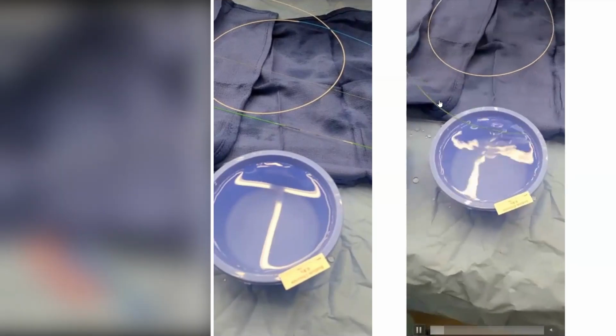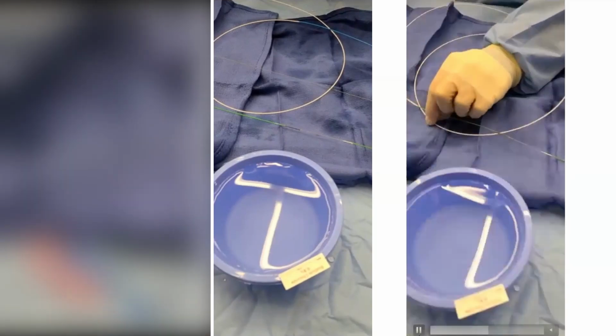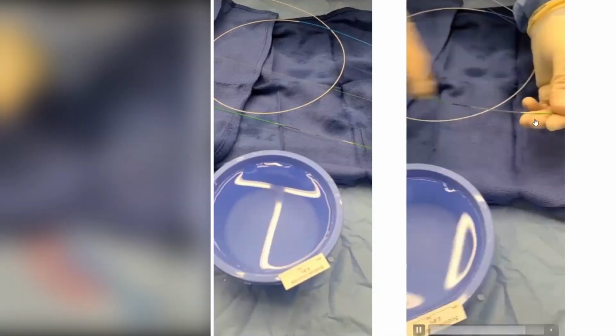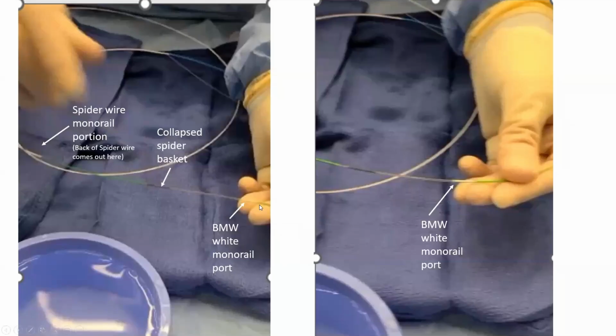So we pull it in the catheter and we position it, as you will see, in that transparent portion here. Then we advance that green catheter over the BMW wire, and the BMW wire will come exactly from here, from that white area, which is actually the monorail portion for the BMW wire. So this is how the spider catheter is. You have the BMW white monorail port, behind which you station the collapsed spider basket in the transparent portion. Then behind it, at the back end of the green portion, you'll have the spider wire monorail portion.